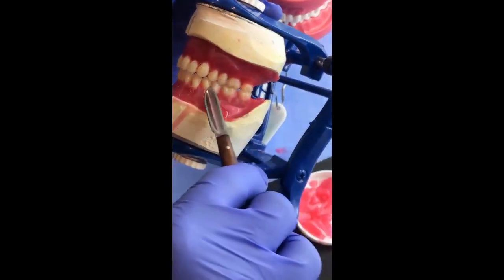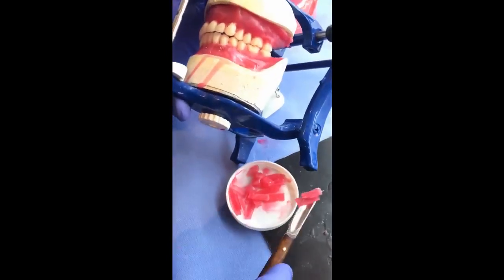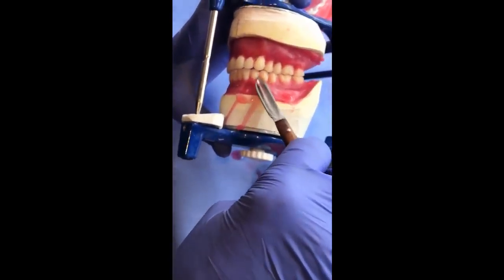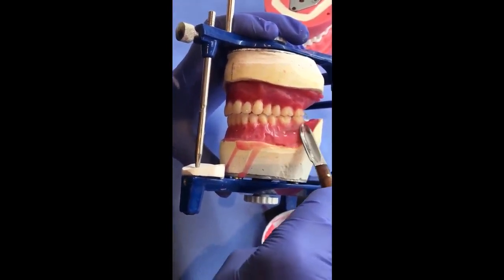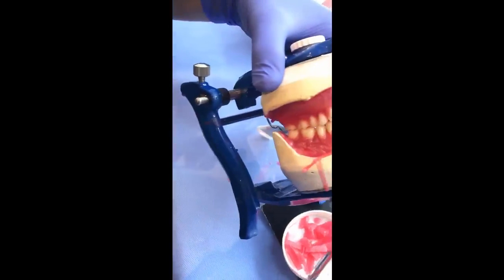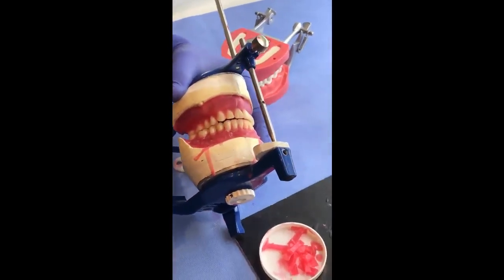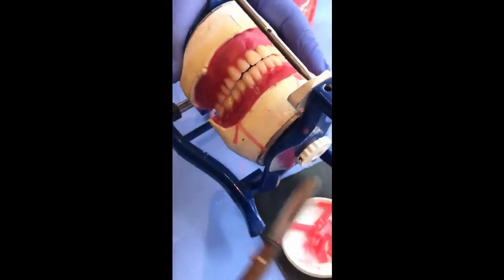Now this technique will prevent any voids in the wax during the addition of wax, and you guarantee a coherent thickness of wax. Now you can adapt a sheet of wax to the labial surface, but sometimes the wax will separate when it becomes layers, but this technique will prevent the separation during carving. Now, as you see here, I'm adding to the labial surface of the lower teeth.